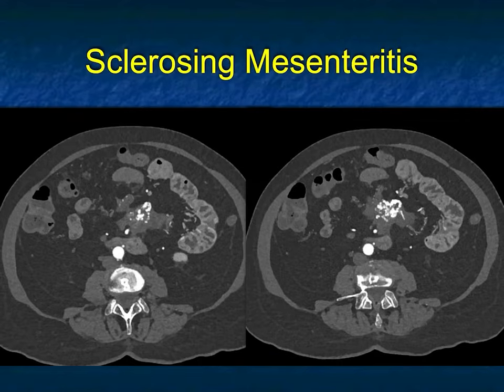And this was sclerosing mesenteritis. A really nice example, and again, it could be challenging. You could do a biopsy, but what if the biopsy comes back negative? Then you're kind of stuck. People have used dotatate scans at times because dotatate is about 90% of the time positive if you have a neuroendocrine tumor. So if it's negative, you're more likely, not 100% specific, but you're more likely to be dealing with sclerosing mesenteritis. A really nice case.